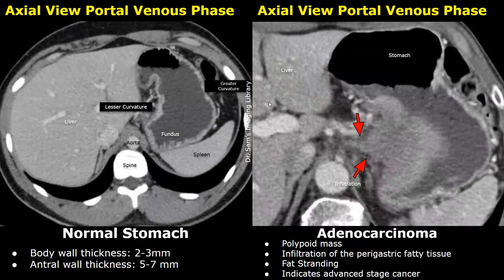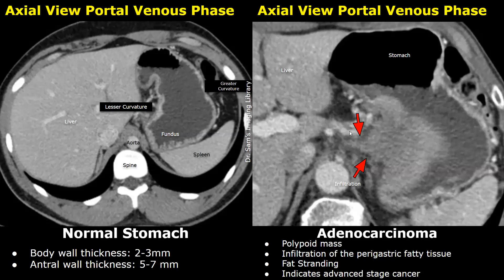Here is another case of adenocarcinoma. There is a large enhancing polypoid mass; the abnormally increased size indicates deeper invasion. There is fat stranding with increased density of the fat tissues, meaning the tumor has invaded beyond the serosal layer of the stomach, indicating advanced stage cancer.